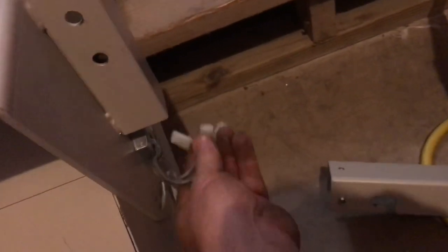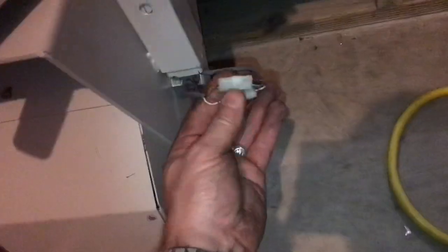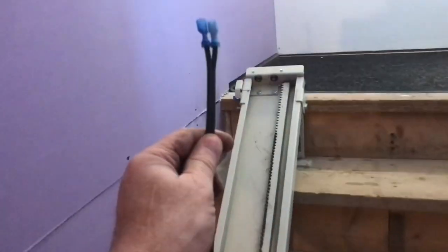Add the chair into place — there's some connectors. Be careful not to crimp any of the wires. There are wire connections on the seat, and there are also wire connections to the charger. There's a long wire that'll run all the way up the stairs to the top of the unit.